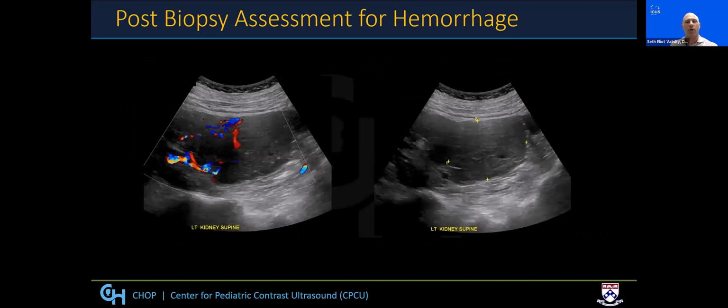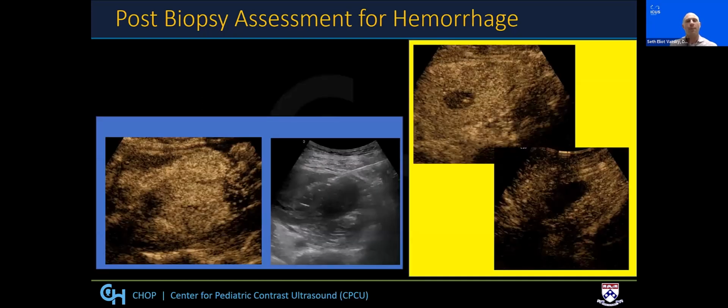So the patient went on for ultrasound and biopsy. We can see the lesion was well localized and identifiable on grayscale ultrasound. On pre-biopsy contrast-enhanced ultrasound in the blue box, the lesion rapidly enhanced, confirming more profound vascularity associated with the lesion when compared to the MRI.